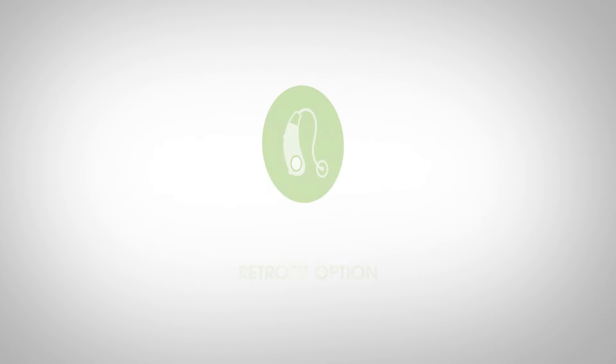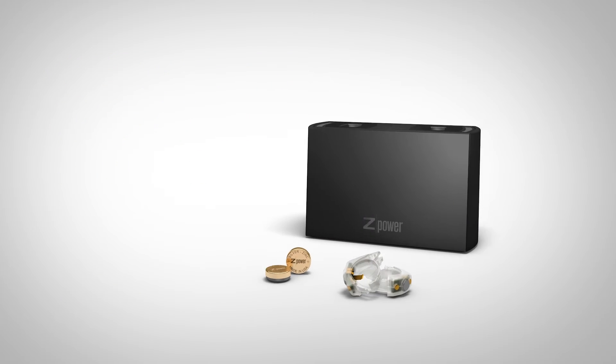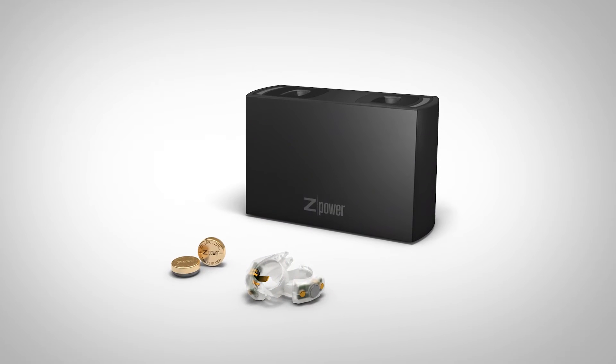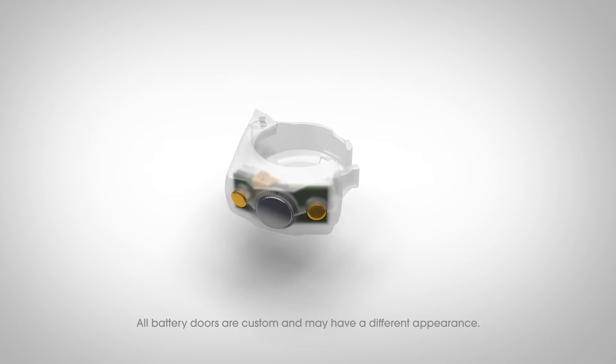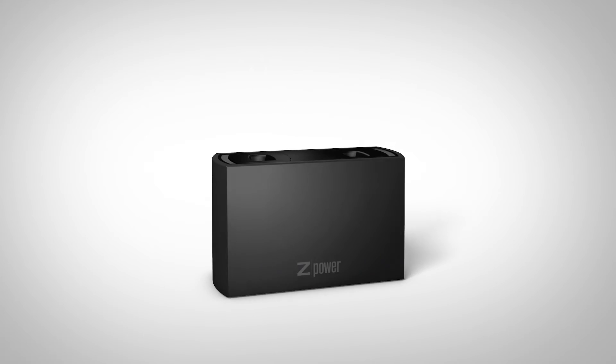Let's take a look at the different components and how they work together. The Z-Power rechargeable system is made up of three components: the battery assembly module (BAM), the battery door module (BDM), and the Z-Power charger.